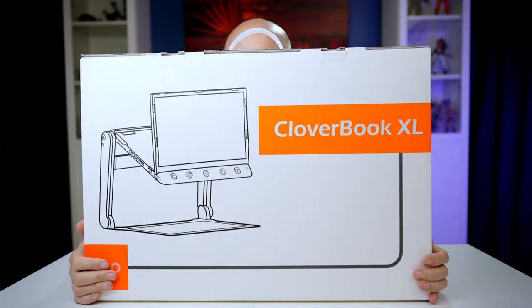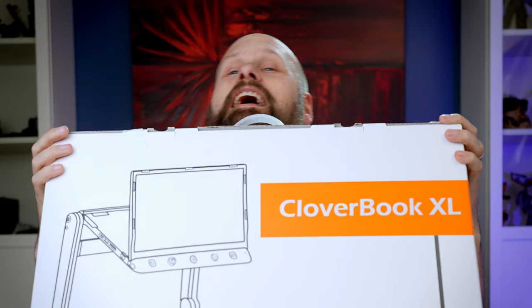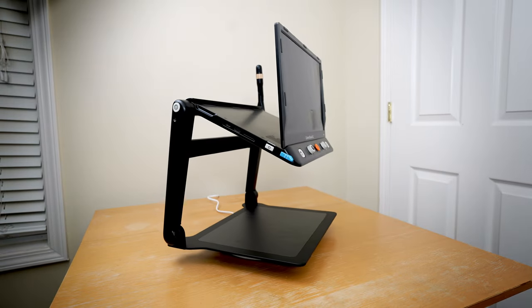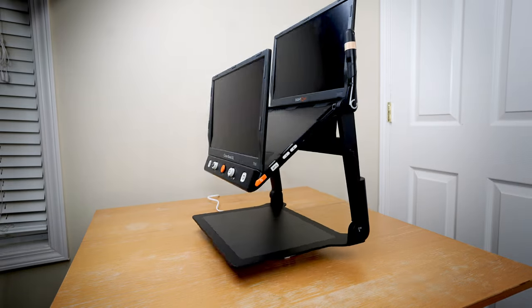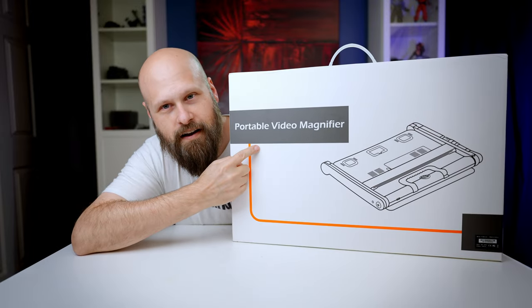My all-time favorite video magnifier just got a huge upgrade and it is even bigger and better than before. This is the CloverBook XL, the successor to the very popular CloverBook Pro, which was probably my all-time favorite portable video magnifier.